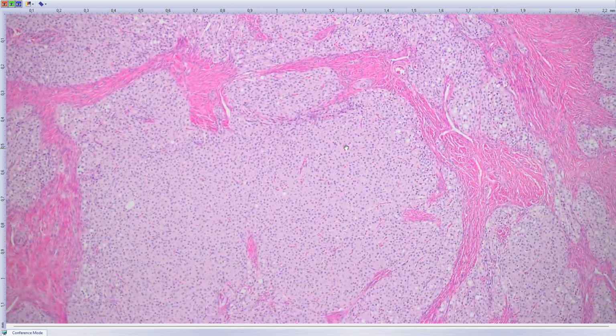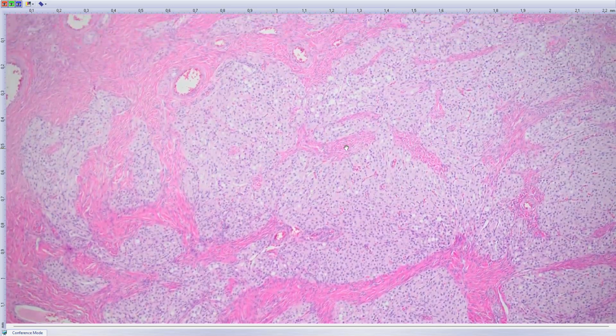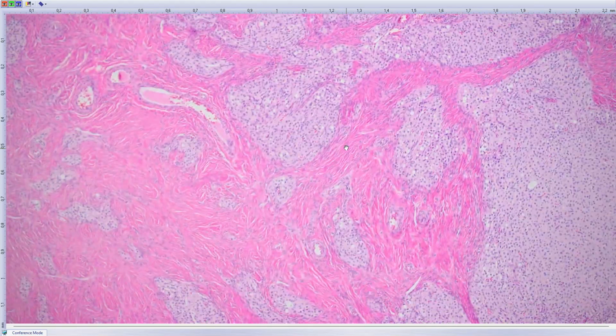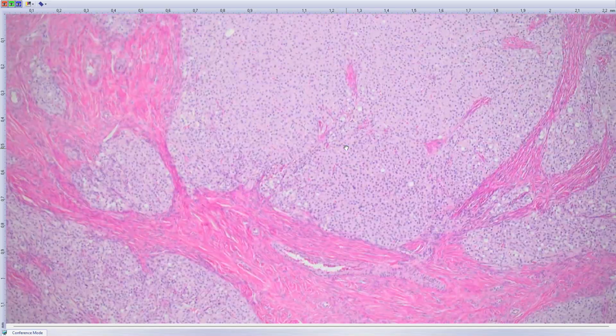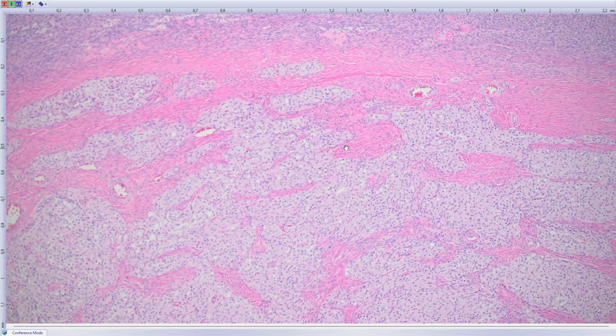And in the ovary, there is an established diagnosis of solid pseudopapillary neoplasm, and these tumors are regarded as analogous to those in the pancreas, which is further proved by identical immunohistochemistry and genetic analysis.